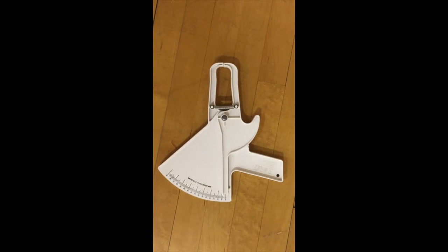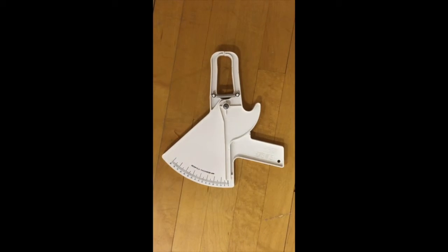The caliper should be placed directly on the skin surface 1 centimeter away from the thumb and finger, perpendicular to the skin fold and halfway between the crest and the base of the fold. The pinch should be maintained while reading the caliper. Wait 1 to 2 seconds, not longer, before reading the caliper.